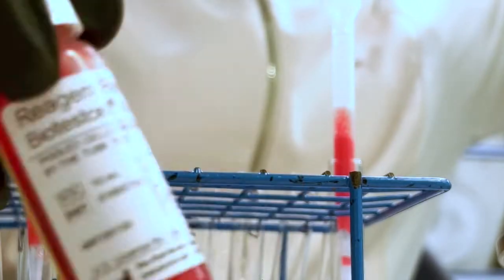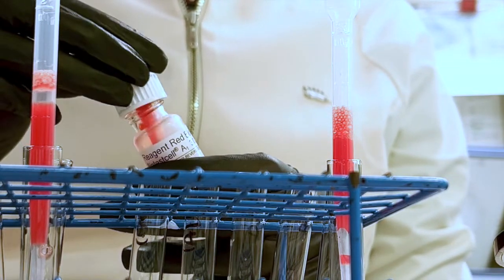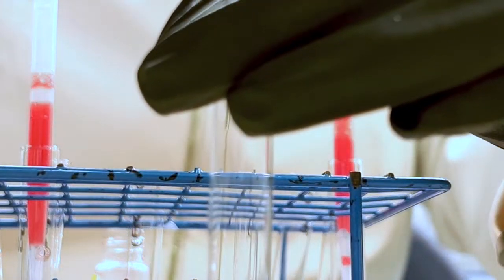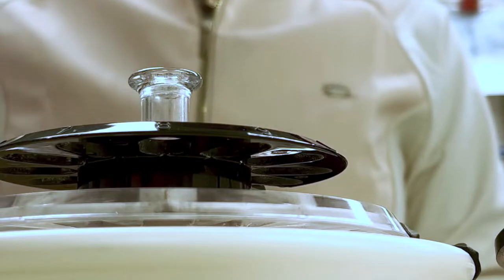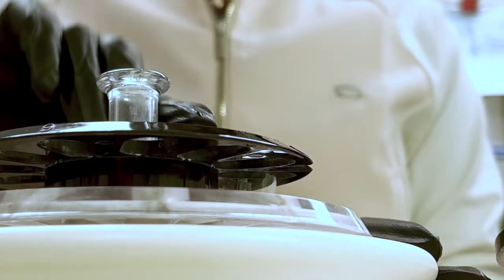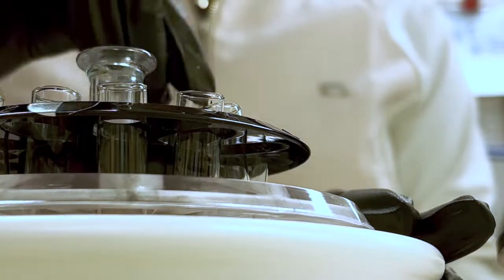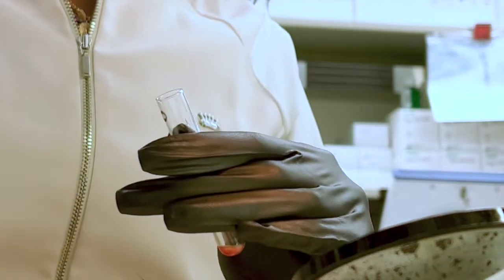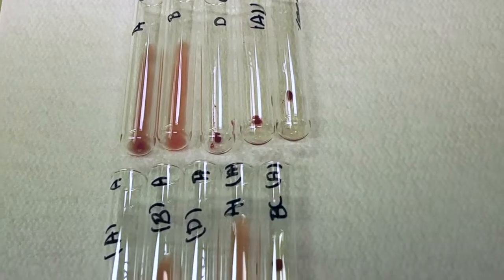And now I am mixing up my red cells for my reverse type. Once your tubes are done spinning, you're going to look under your tube agglutination viewer and look for any agglutination. I have to get the button off the bottom, I just have to, but here are the results.